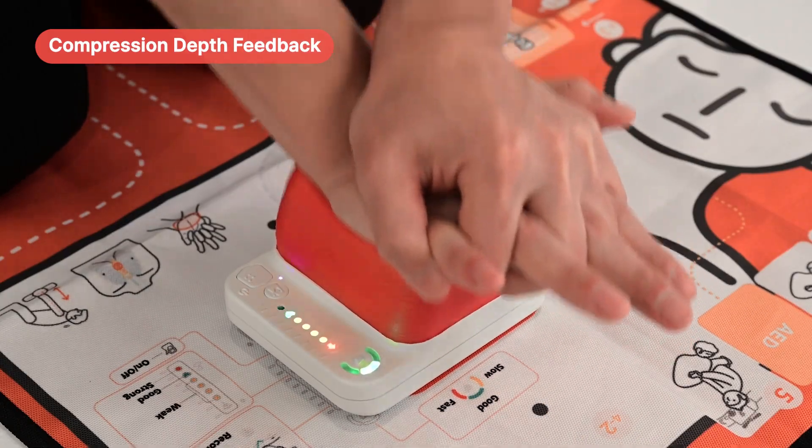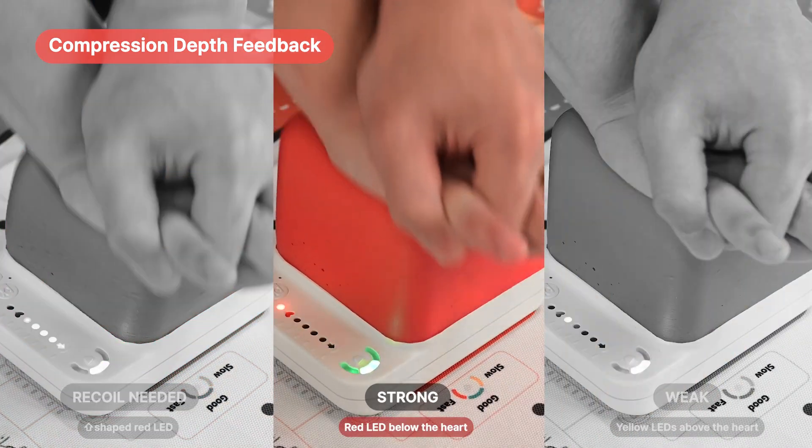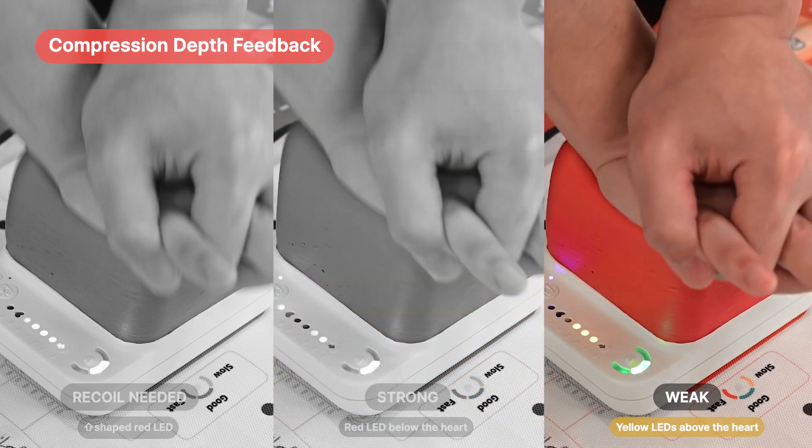If there's insufficient recoil, the arrow-shaped red LED will illuminate. For strong compression, the bottom red LED will light up, and if it's too weak, the yellow LED above the heart will illuminate.